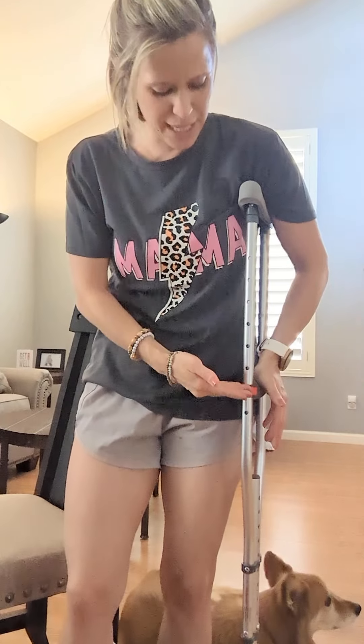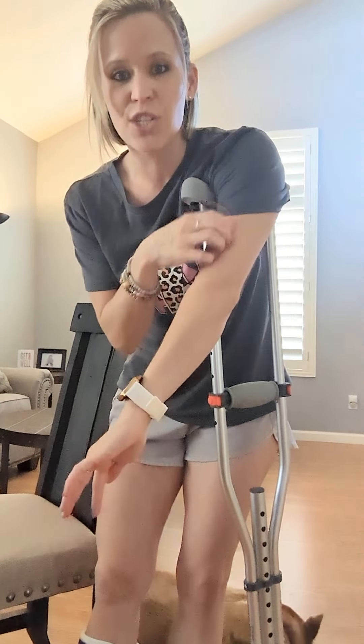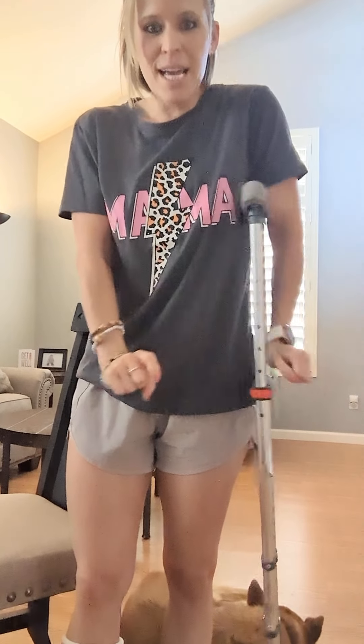If the handle is way up high or way down low, you need to adjust that. Otherwise your elbow is going to be doing funky things. You're going to end up with a lot of irritation in the tendons in your wrist. So you want to stand next to it, you want your wrist to be kind of neutral and upright and not cocked in super funky positions.